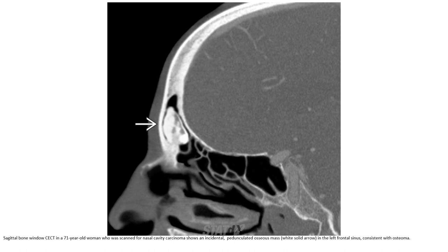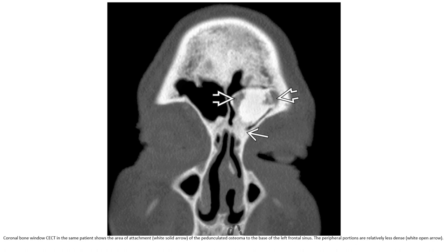This is a contrast CT in a 71-year-old woman who was scanned for nasal cavity carcinoma. An incidental pedunculated osteoma in the left frontal sinus is seen, consistent with osteoma. A contrasting CT in the same patient shows the area of attachment of the pedunculated osteoma to the base of the left frontal sinus.